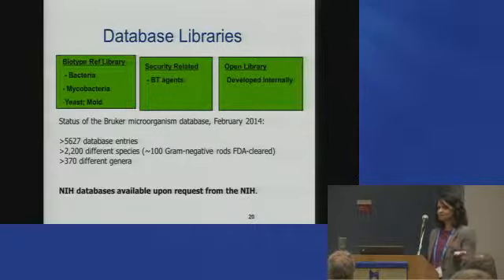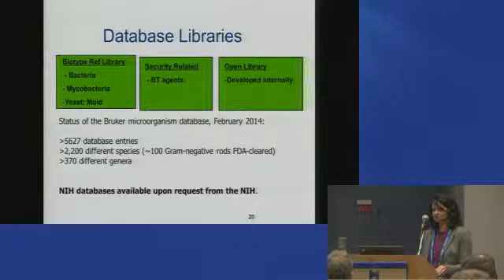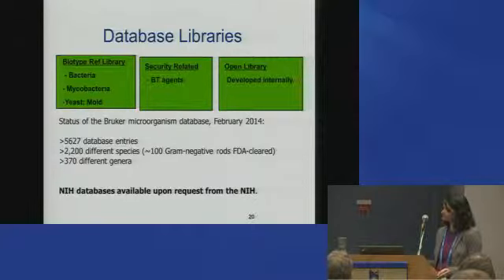But these are organisms that you can encounter in the lab with just some sort of history on a patient. So you really don't want to be exposing your lab technicians to any of these organisms if you have a way in which to identify them quickly, so that there's less processing and fewer biochemical tests being set up for these organisms. So it does make sense to get both of these databases which come along with your instrument.